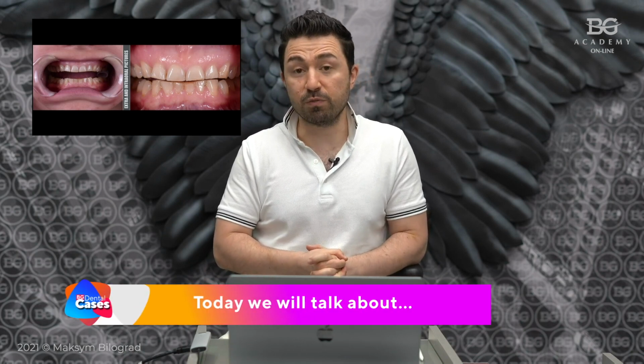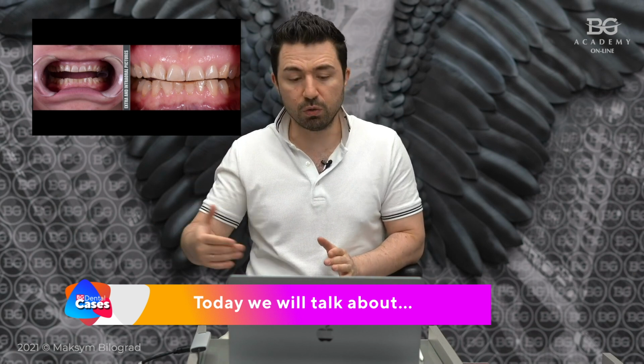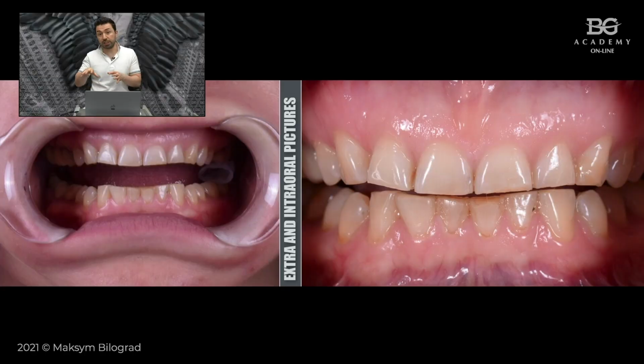Hello dear friends, we are back with a new episode of the BG Dental Cases. This time I prepared for you a very interesting presentation that is dedicated to aesthetic and functional restorations. As you can see from the initial slide here, we have a tooth wear, so we have to do a lot of work. Actually, it is full mouth rehabilitation, but today I will focus mainly on the posterior region, explaining different types of partial bonded restoration rehabilitating posterior teeth.